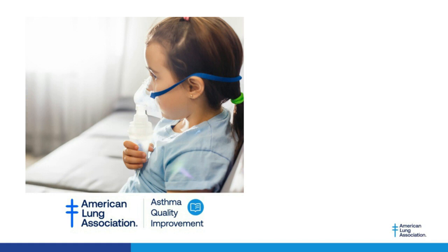Thank you. Similar question related to aerosol generating procedures comes from Matthew. Matthew did not believe that spirometry was originally listed as an aerosol generating procedure. Only nebulizers were. Has this been updated and now CDC is including both of them as aerosol generating procedures? No, actually, I have not seen anything from the CDC, an update that adds spirometry.